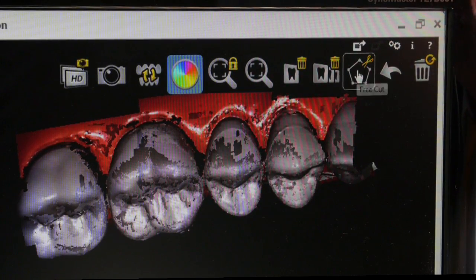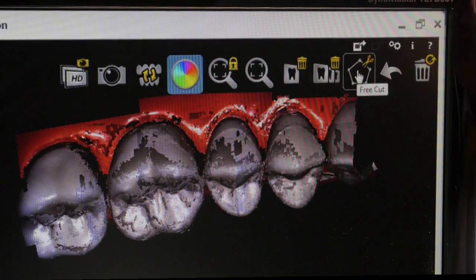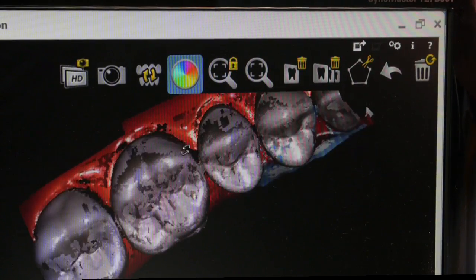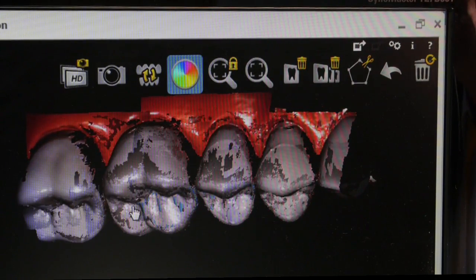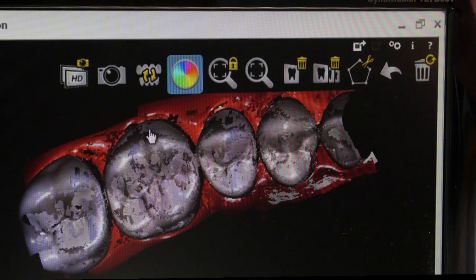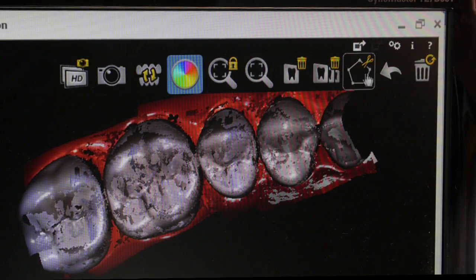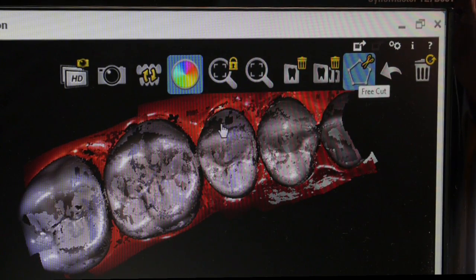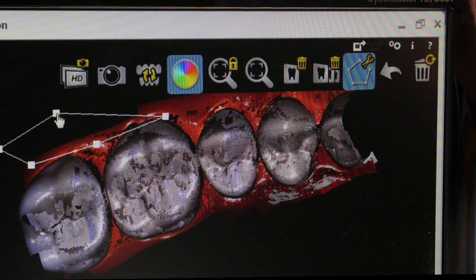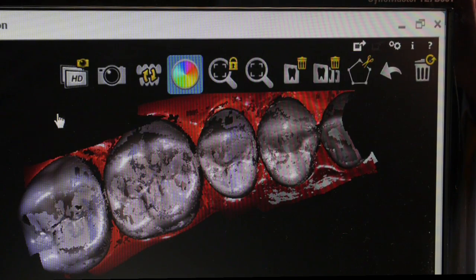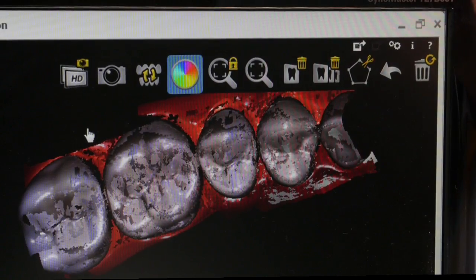This icon here is a free cut. So say, for example, you capture some elements intraorally that you don't want — i.e. tongue, cheek — you could go round with this free cut tool and delete out. Just double click at the end and it will delete everything inside that free cut tool.